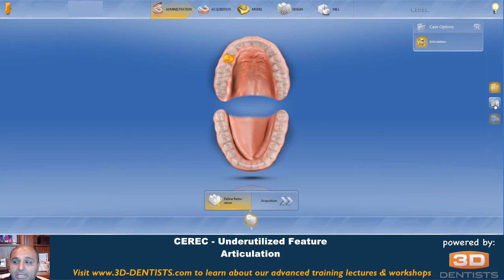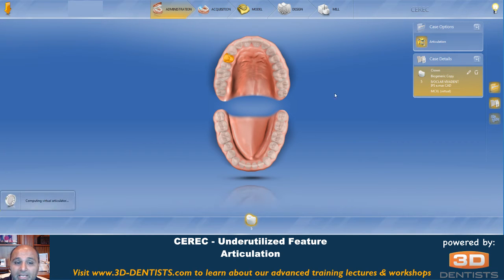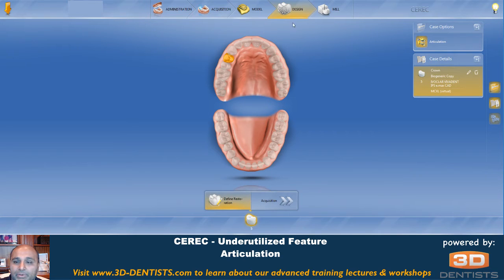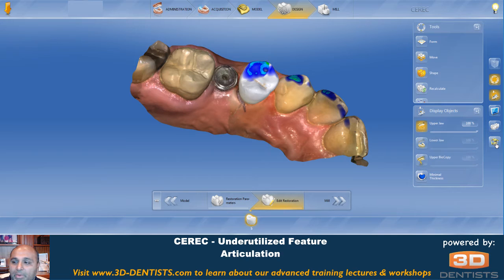Once we come back here, you'll see we have the administration screen with the case details button available. As soon as we click case details — case options — you can see articulation is available. We click this to turn it on. The articulation switches from off to on, and here you can see we're computing the virtual articulator. Now when we go back to design mode, we have the articulation box that we can check.